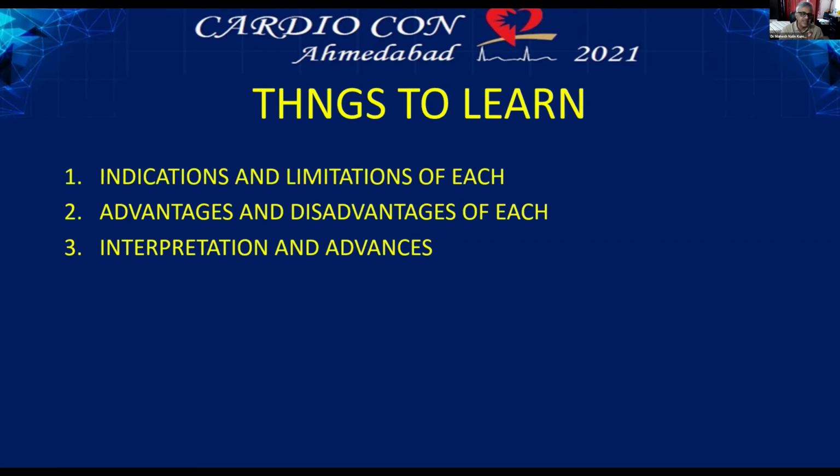The 15% target lesion failure can be brought down by 4% if you do proper imaging, not only in TLR cases, even in the original cases where we are doing primary angioplasty, the original native vessel angioplasty. If you do imaging, you can bring down the TLF by 4%. So imaging is mandatory. Imaging as far as possible.